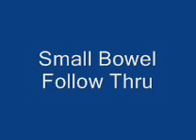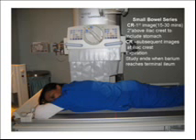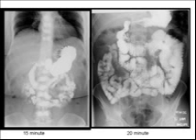Small bowel series, PA. Patient is prone unless unable. Place patient's arms up beside the head. Use support under the ankles. The central ray for the first timed image is 15 to 30 minutes after drinking and is centered 2 inches above iliac crest or high enough to include the stomach. Watch the fluoro.